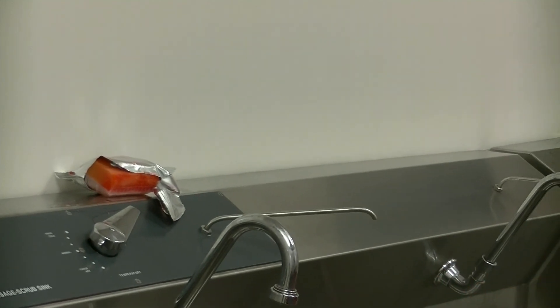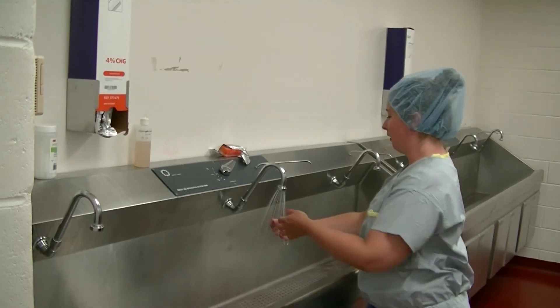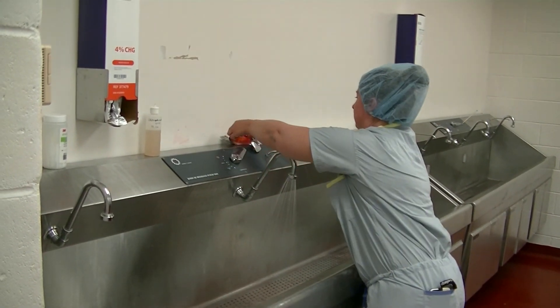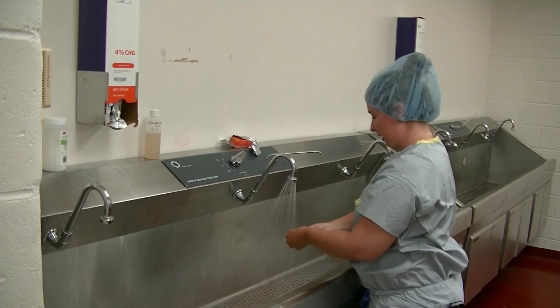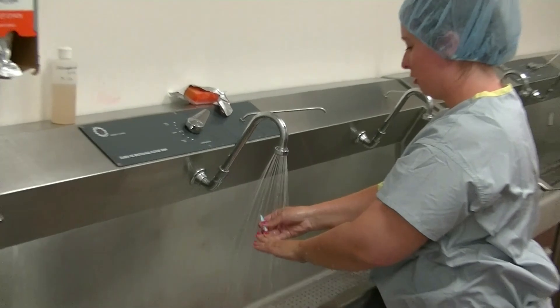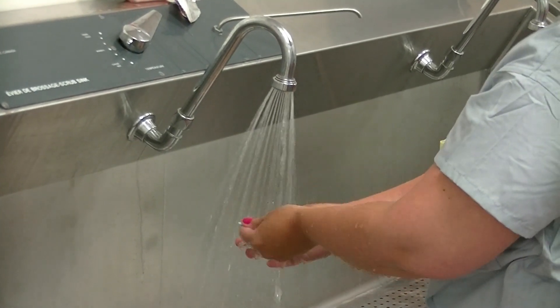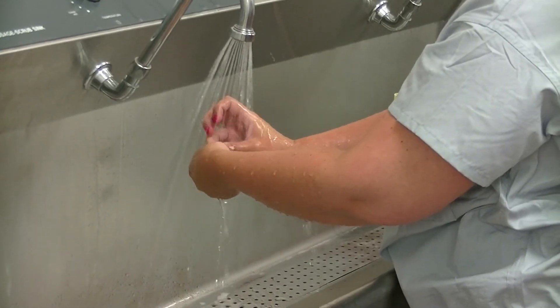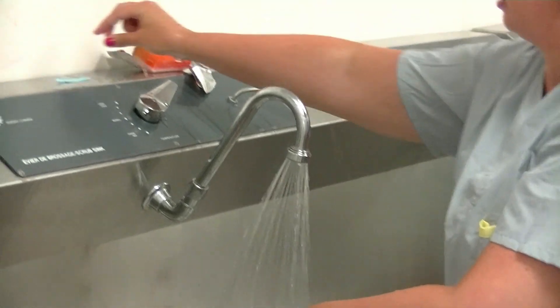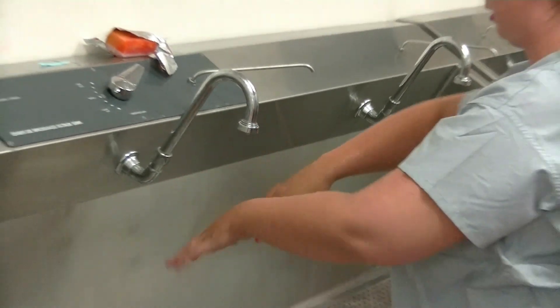Place your scrub brush on the back of the sink, then turn your water on with your knee. Do a quick rinse, then pull out your nail pick and clean underneath all of your nails under the running water. You can put your pick either on the top or in the sink when you're done.